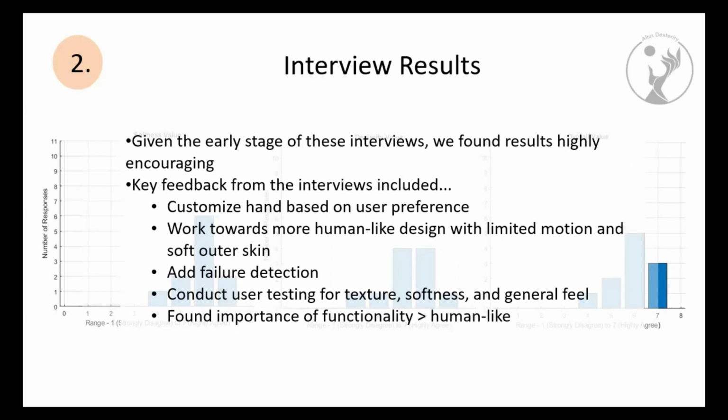customizing the autonomy levels of the hand, either having highly user-controlled devices, if, for example, a user wants to pick up a phone, they slowly control the hand in doing that, versus having assisted autonomy where you just hover over a phone or give a vocal command and then the phone gets picked up by the device.